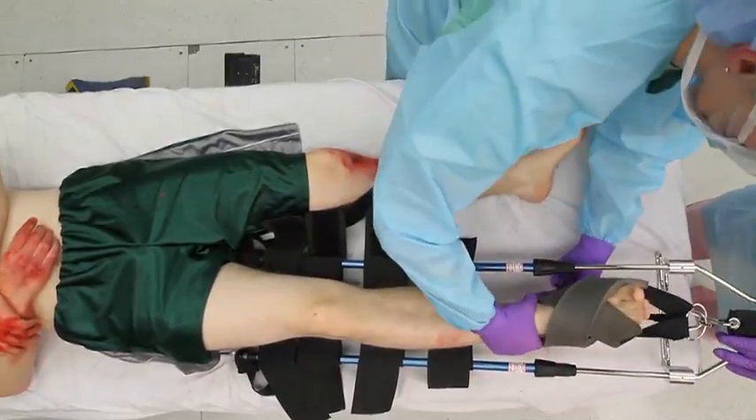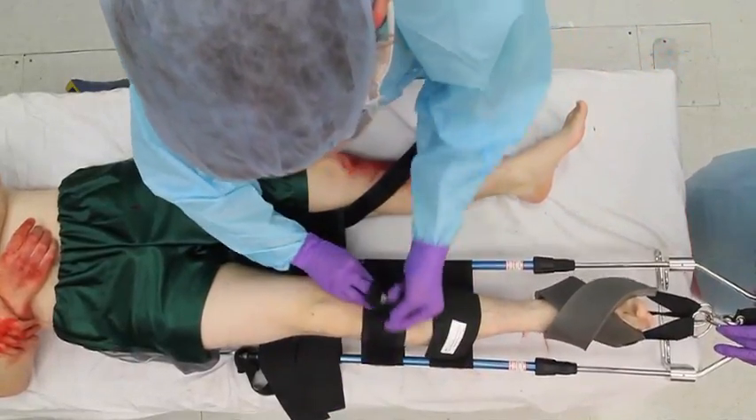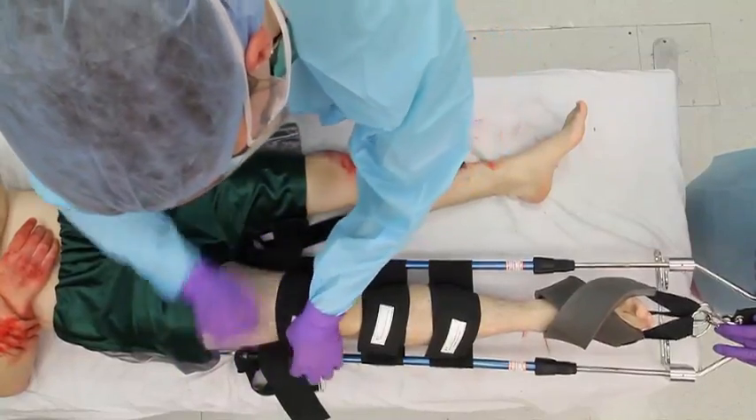If perfusion of the extremity distal to the injury appears worse after applying traction, gradually release the traction. Secure the remaining straps.